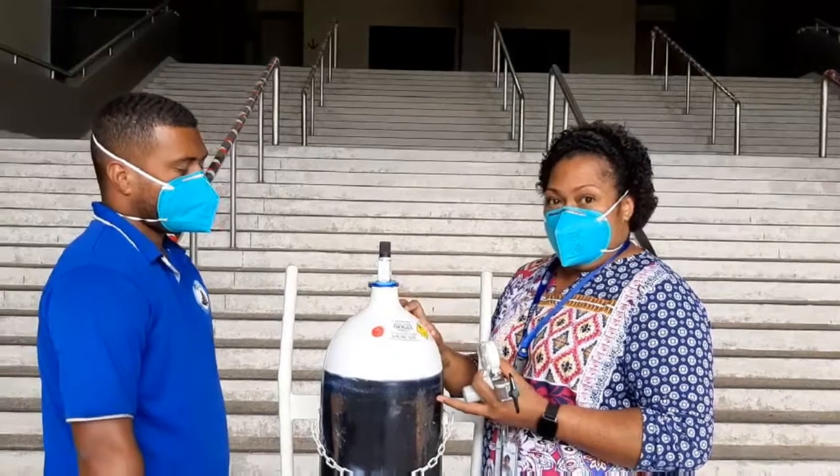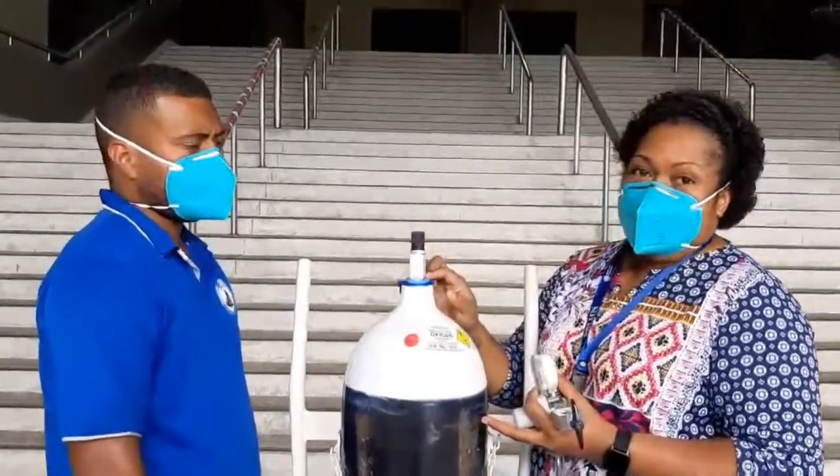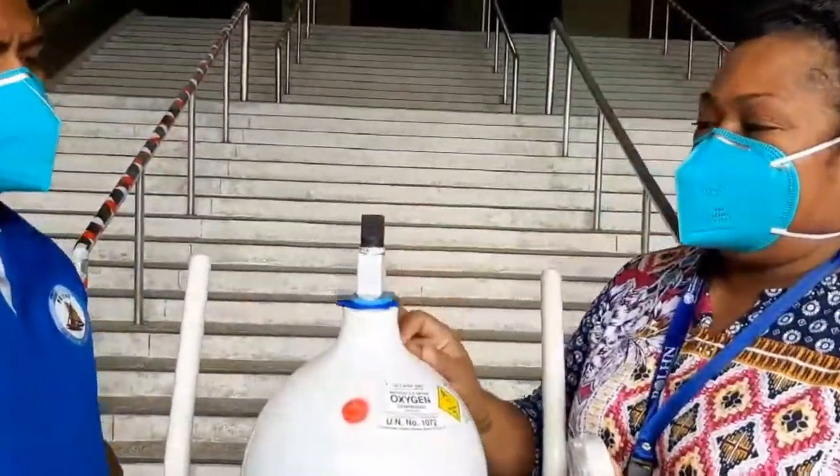This is a new oxygen cylinder, so we'll need to first remove the seal, and you can do that by pulling it up.